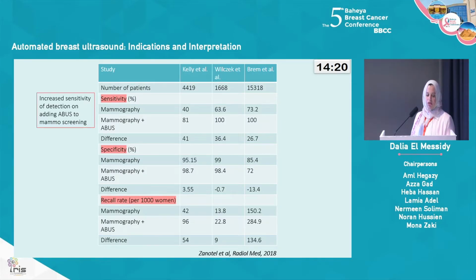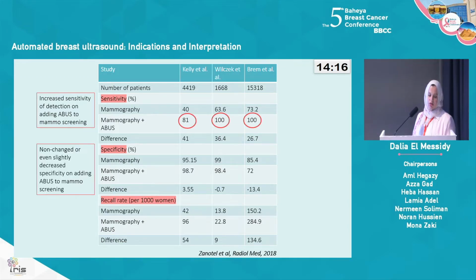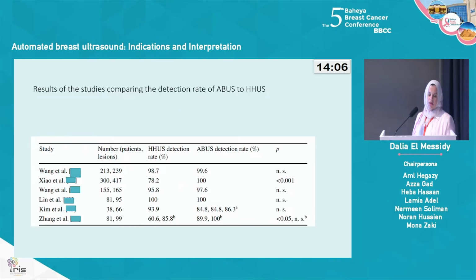Adding automated breast ultrasound to mammography increased the sensitivity of detection. However, the specificity was not changed or even slightly reduced. And the recall rate was again increased. Comparing automated breast ultrasound to handheld ultrasound, it has a comparable detection rate.